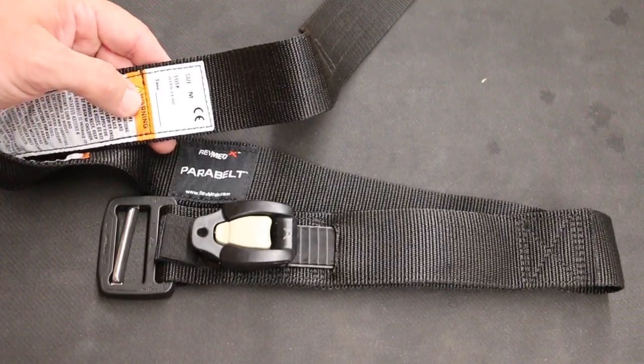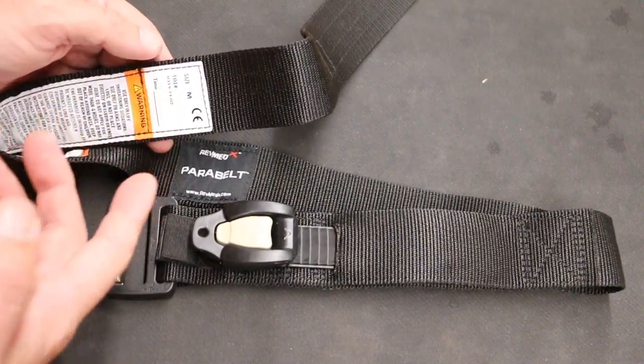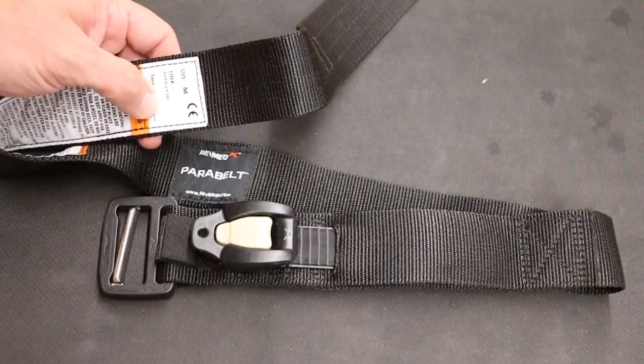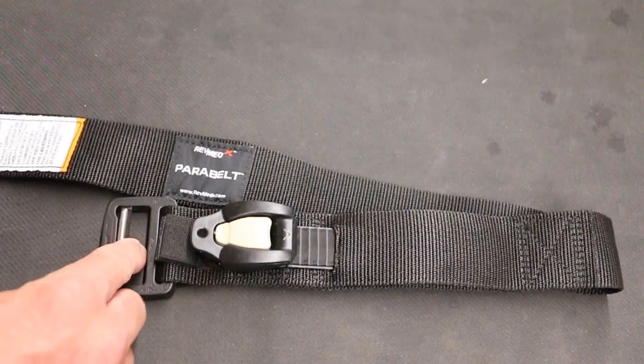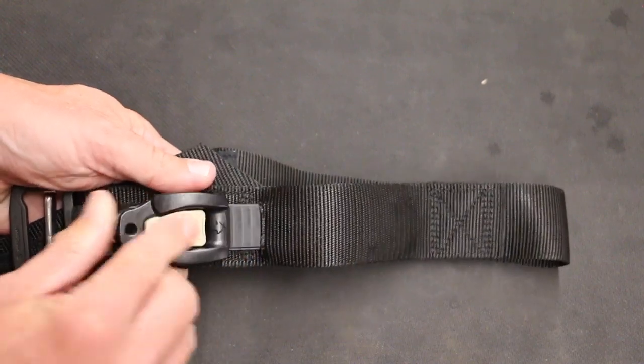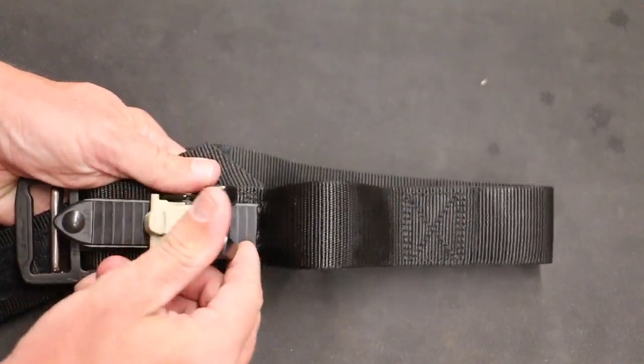So we'll take a little bit closer look at the belt here. You do order your size that you need for your waist size when you order it, and then it has a place to write the time down if you use it. You have a nice buckle here, a nice cover buckle that you're going to apply, and then this is our ratcheting system to make it a tourniquet.